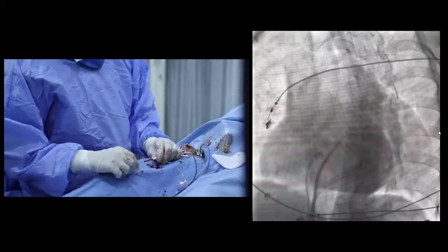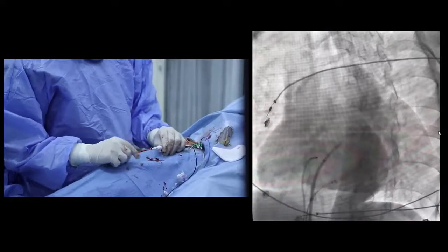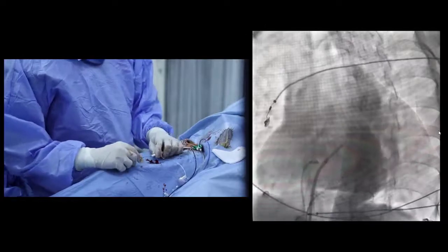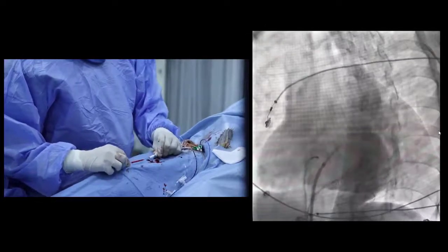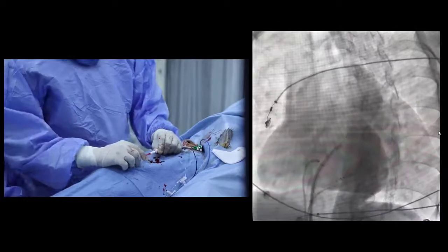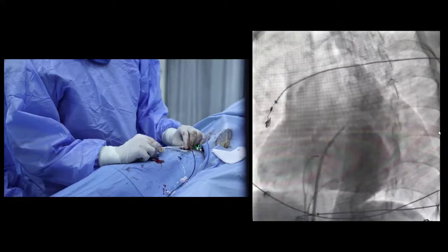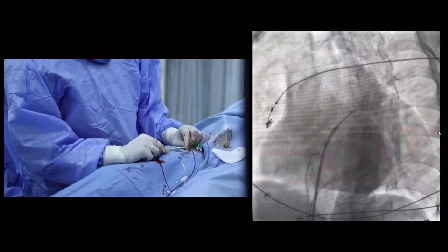Then we insert the long wire via the dilator of the long sheath, to be parked in one of the pulmonary veins, so that we can guide the dilator and the long sheath to bypass the puncture of the interatrial septum completely into the left atrium, so that we can get the catheter into the left atrium.